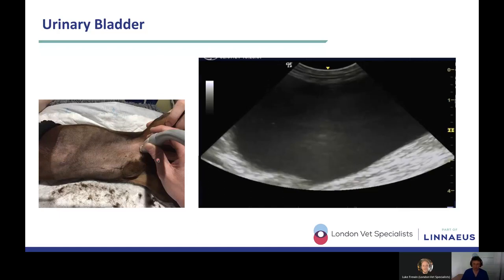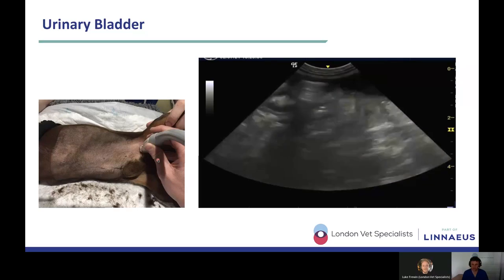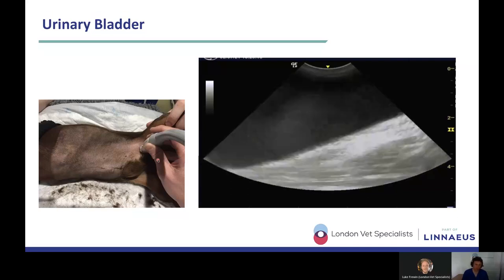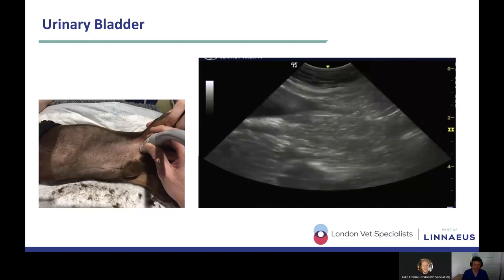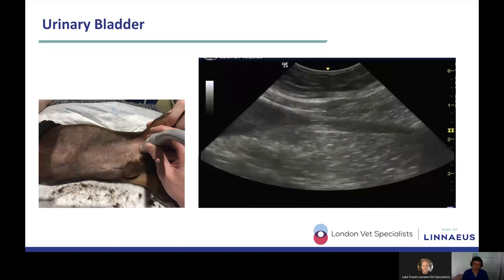And most of you guys that have picked up a probe, you will be pretty confident about finding urinary bladders. I'm sure that tons of you, even if you're just starting out, will have done cystos. So you pop the probe in the mid-abdomen caudally, so the caudal mid-abdomen, and you're going to find the urinary bladder, essentially, and it looks exactly as it's expected to look, like a very smoothly marginated anechoic balloon.